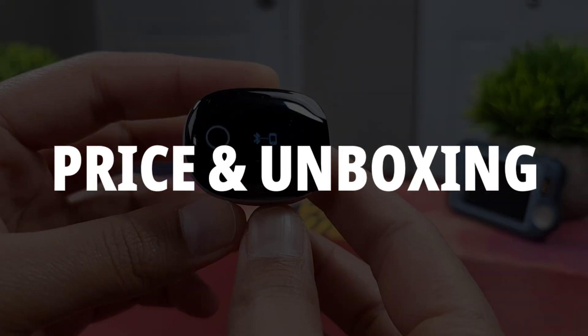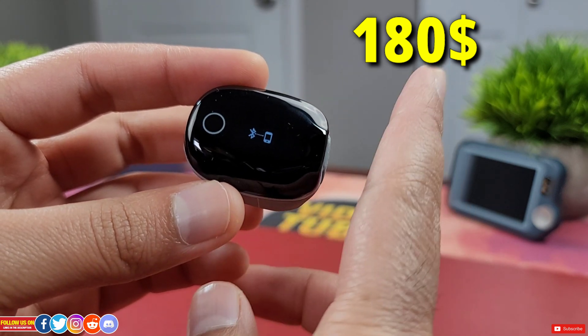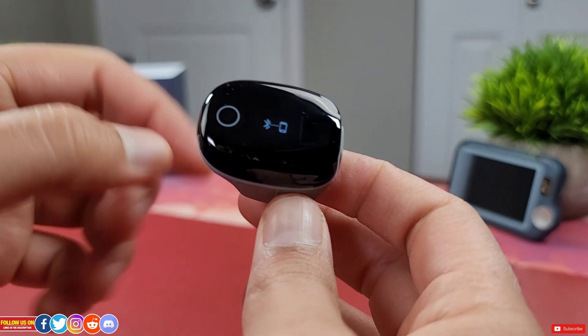Let's start with price and unboxing. This O2 ring is listed on Amazon for only $180 US at the time of filming this video, and the price may vary at the seller's discretion. Check out the links in the video description for a direct link to this product and any discounts.